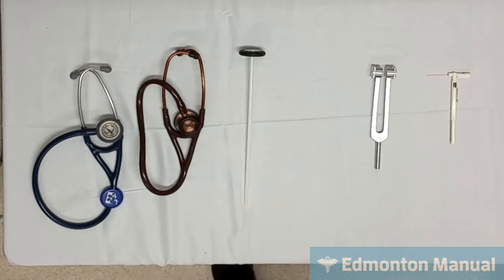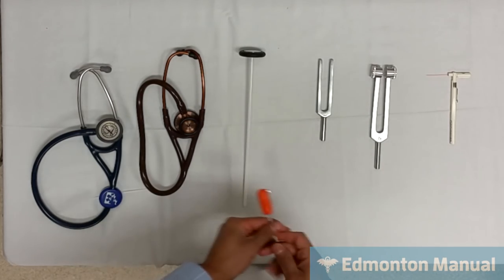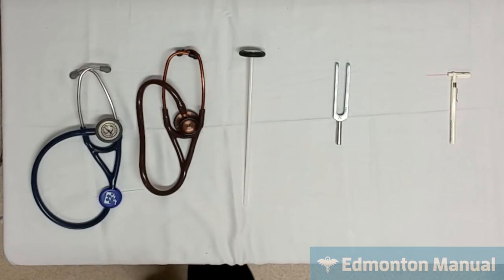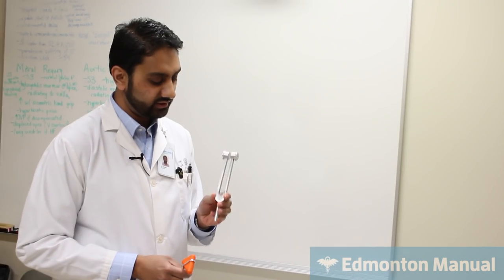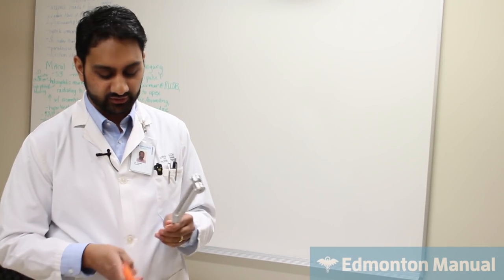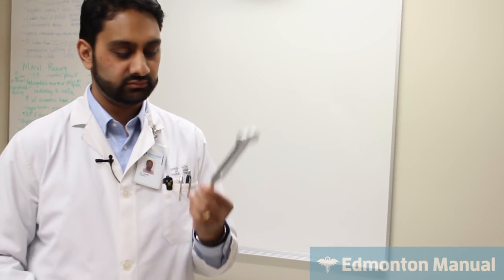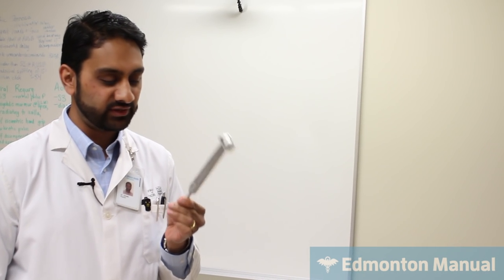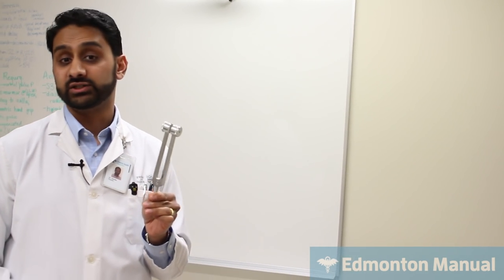So we're going to move on now, and we're going to be testing with the 128 hertz tuning fork here. So this tuning fork is lower frequency, and we will hear that as soon as we hit it. Okay. I think we heard the ting associated with metal on metal, but trust me, it does sound lower. And so with this tuning fork, this is ideal for use for vibration testing.